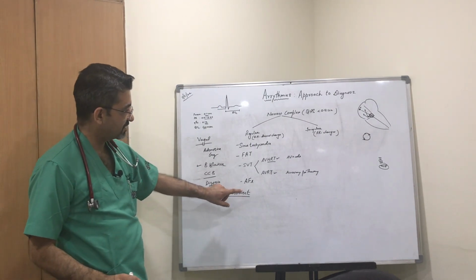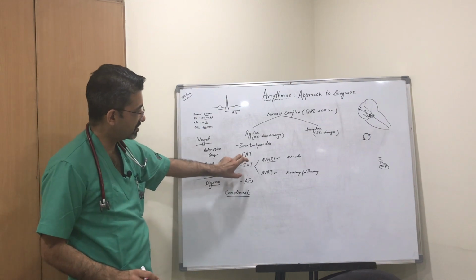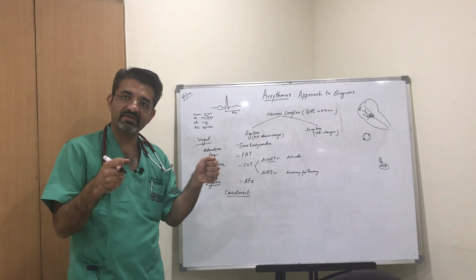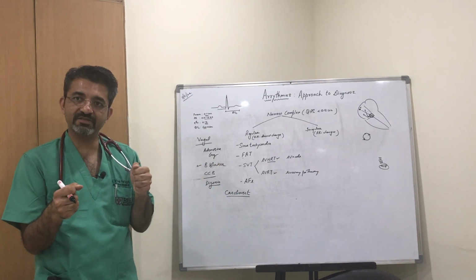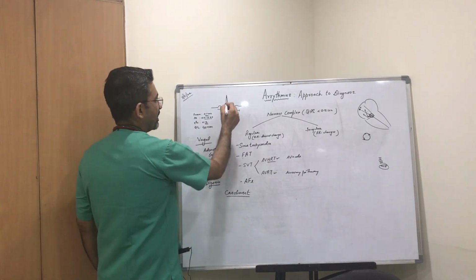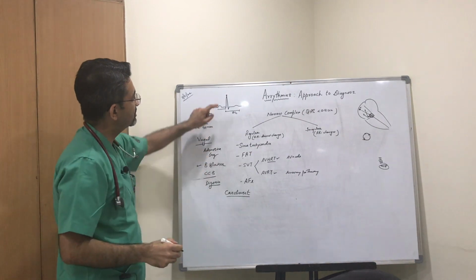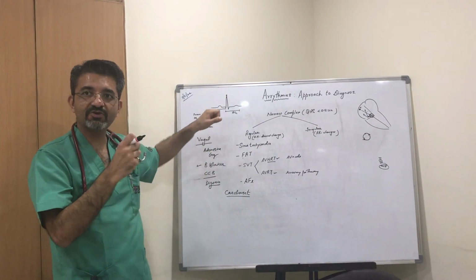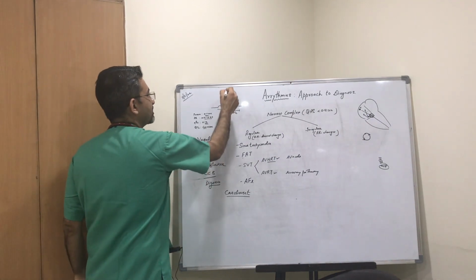Cardioversion means you are cardioverting the rhythm into normal sinus rhythm, but the cardioversion is synchronized. Okay, what is synchronization? At the upstroke, this R point, this inflection point will be captured by your paddles, and the delivery of current will be exactly here.